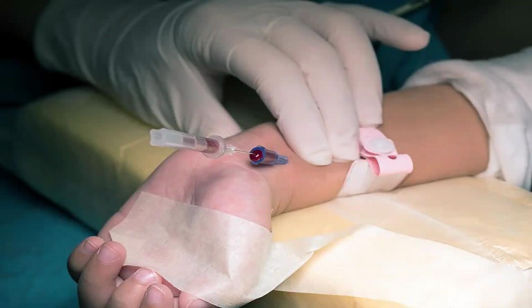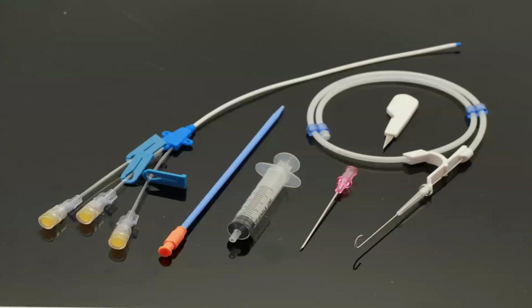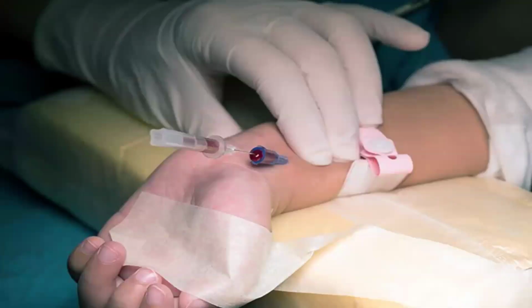Once you clean the area with chlorhexidine, having gathered your materials, of course, the Seldinger kit, the syringe, the cannula, and then drape with your wipes. Get all those ready before you start. And then, of course, the guide wire. Clean the area, cover it with a sterile drape.